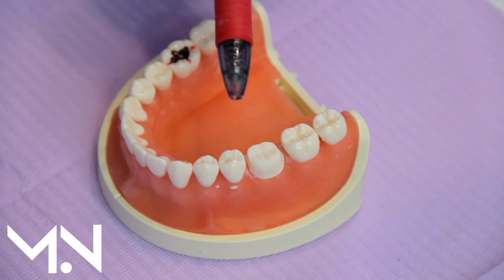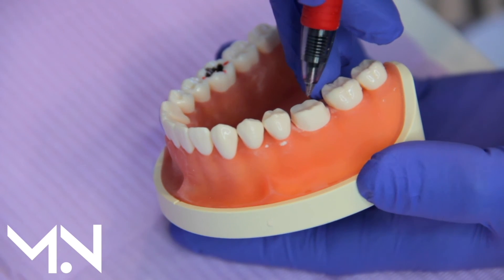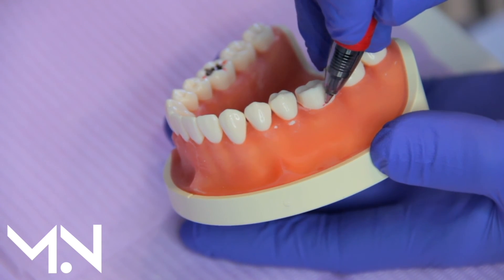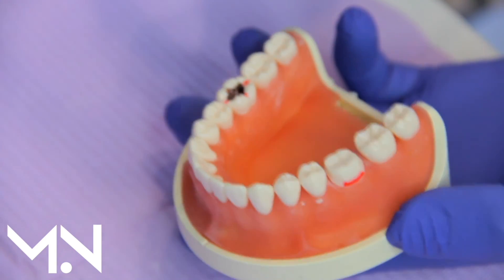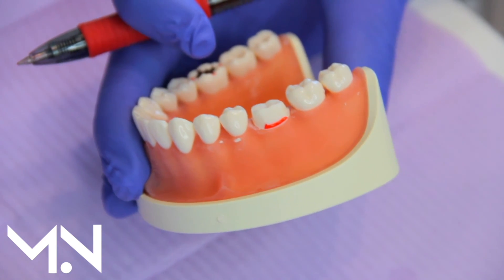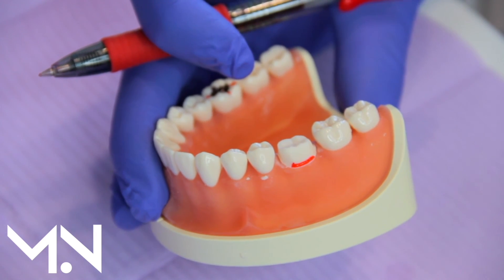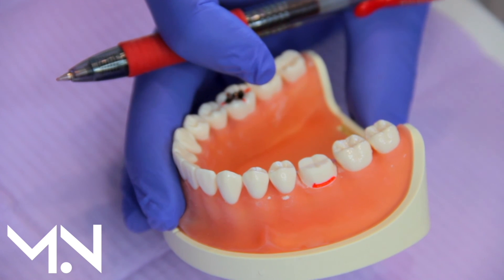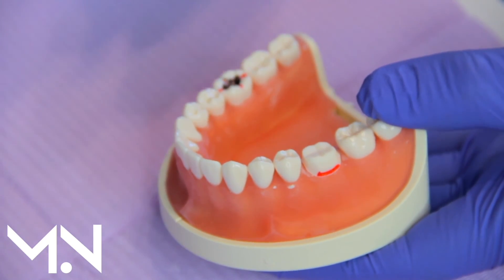Here's our completed crown preparation. This is still considered a conservative crown preparation — the margin isn't as large as in the typical traditional approach, yet this is still about a 70% reduction in tooth structure above the gums just so the crown could be fitted. Our goal was to strengthen the tooth, but in the traditional approach we have to take away more tooth in order to strengthen it — and that's counterintuitive. With adhesion and biomimetic dentistry, we're able to strengthen the tooth while keeping more of the parts that are not damaged.